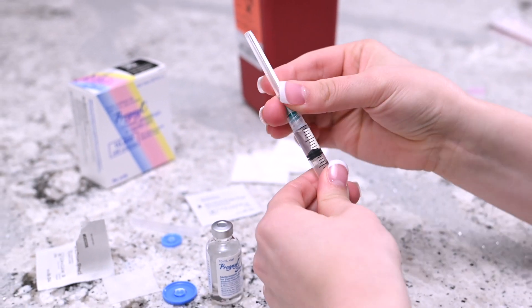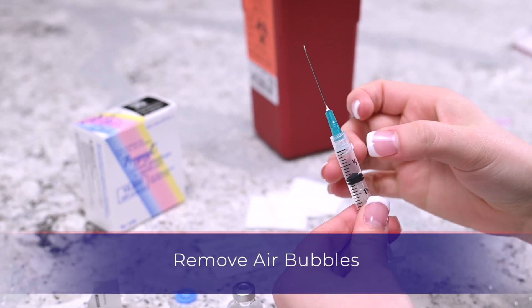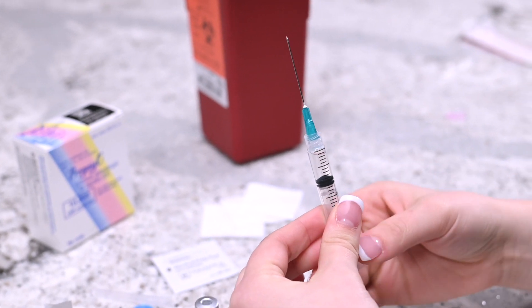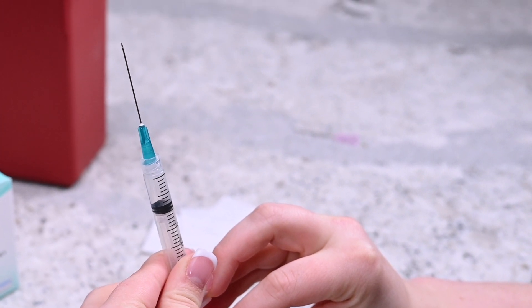Attach the intramuscular needle and remove the cap. Don't let the needle touch anything, including your hands. While holding the needle upright, gently tap the side of the syringe until the air bubbles migrate to the top. Apply slight pressure on the plunger until a drop of liquid appears at the tip of the needle.